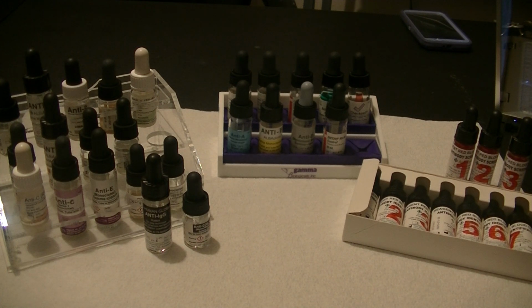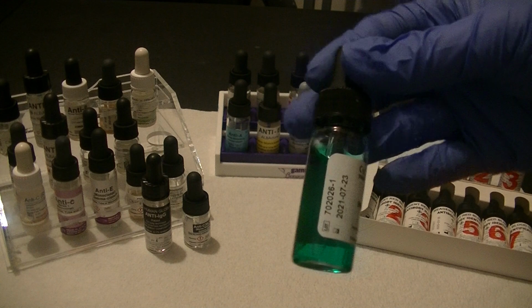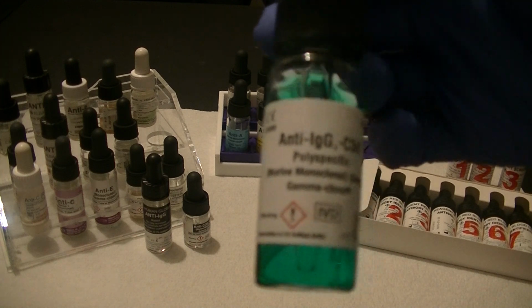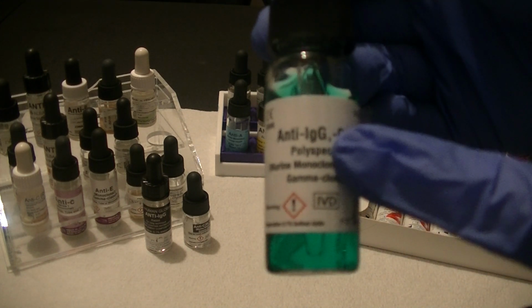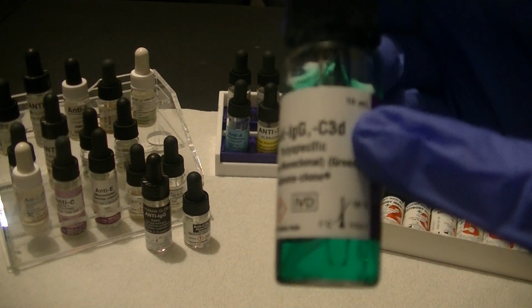One specific type of anti-sera that we use for an important test, known as the indirect antiglobulin test, is an anti-sera known as anti-human globulin. Anti-human globulin is an anti-sera. It can be colored green, and that's what we use in our lab, that has antibodies in it that will bind to any human IgG antibodies. So it's an antibody that binds to human antibodies. It can also bind to complement C3.